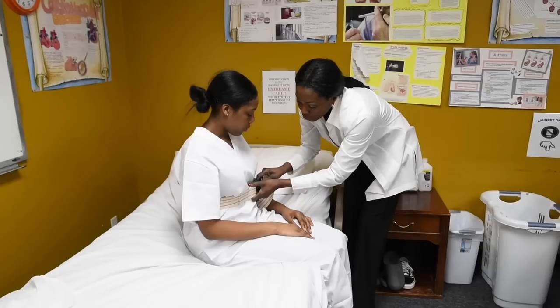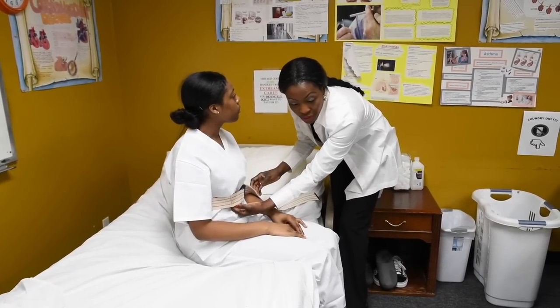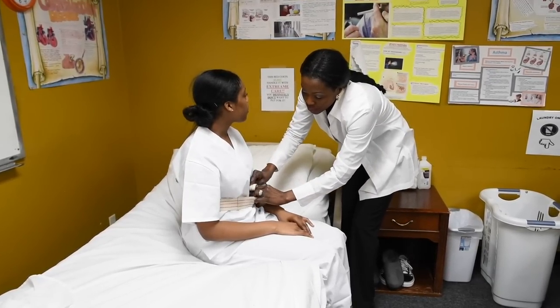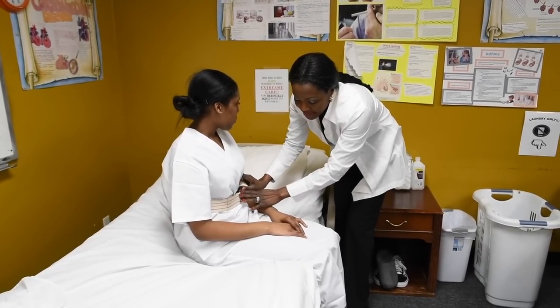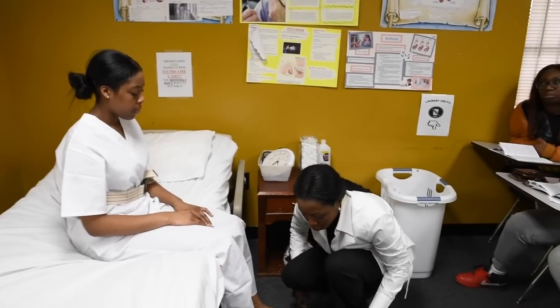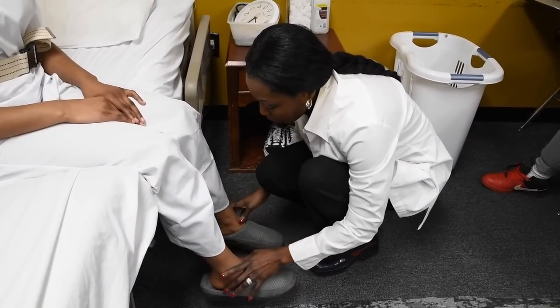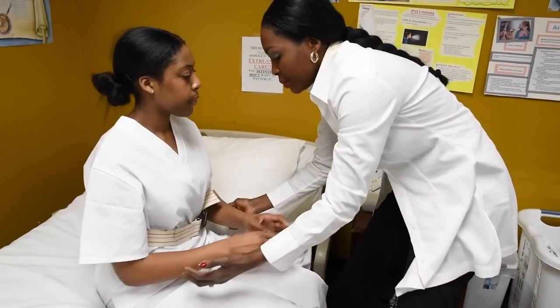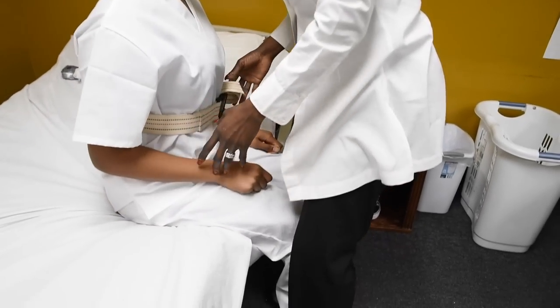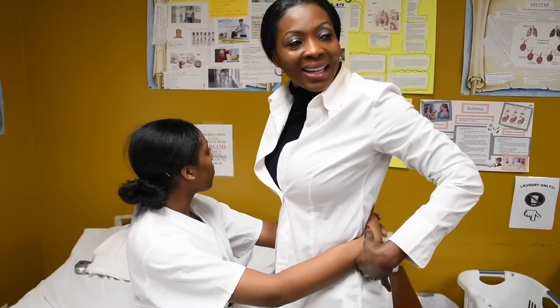We said when we are putting gait belts on our clients, the key word is to make sure it's snugly, okay? Excess belt goes inside, tucked in, okay? Without your client's feet touching the floor, you will put their shoes on. Okay. And now tell them to scoot to the edge of the bed. Okay. Same thing, like transferring clients, like weighing clients, all right?